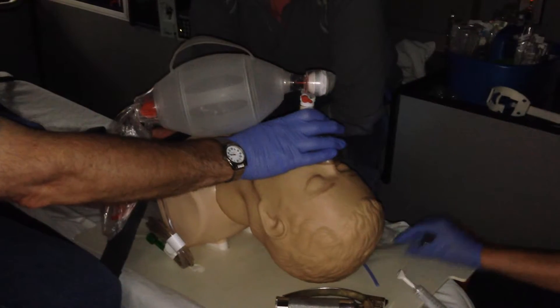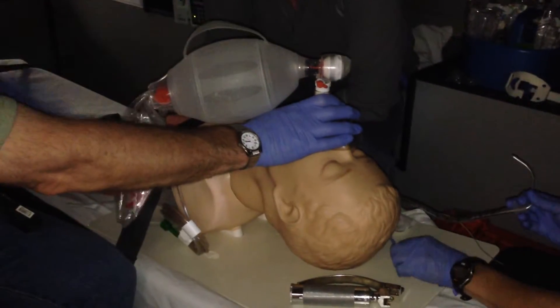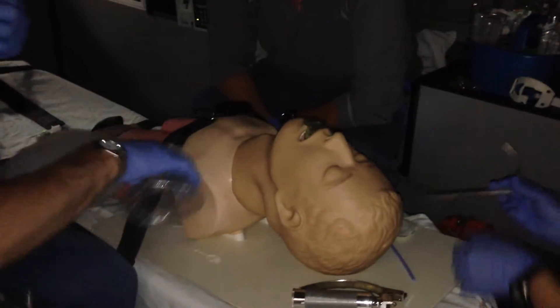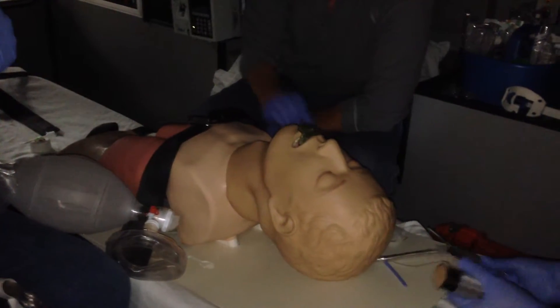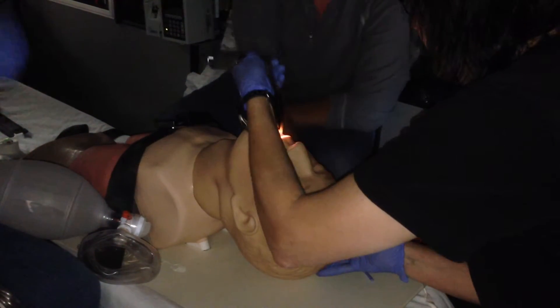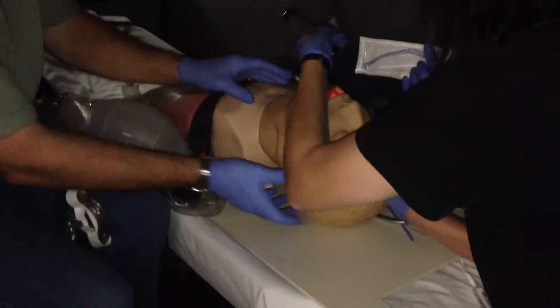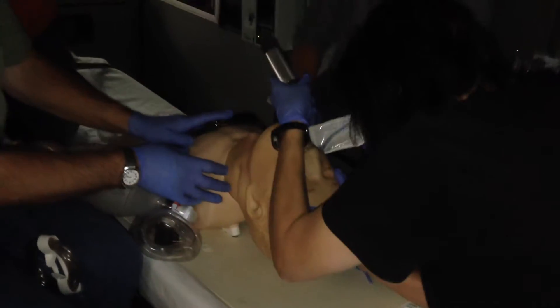Are you ready? Be careful not to blind yourself so that the switch is on the top. You can just hang it off of your shirt right there. Are you ready? Lining up the three axes. We've got suction ready if you need. Getting you into the sniffing position.